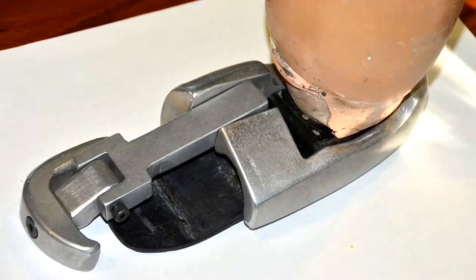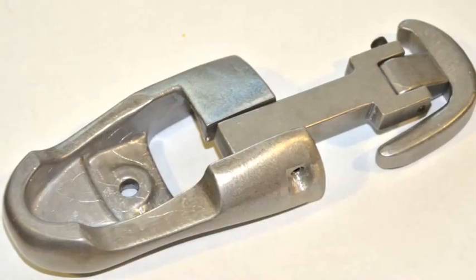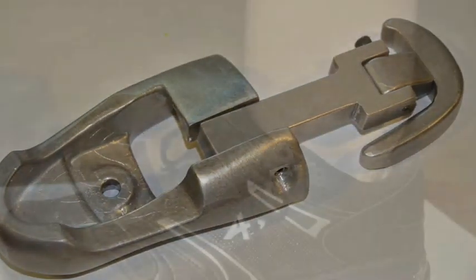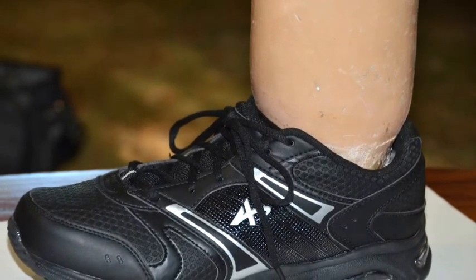One of my old friends got in a motorcycle wreck and lost his foot. He wanted me to make him a prosthetic foot. The old foot was made out of rubber and it disintegrated. I made the new foot out of machinable wax and investment casted it.